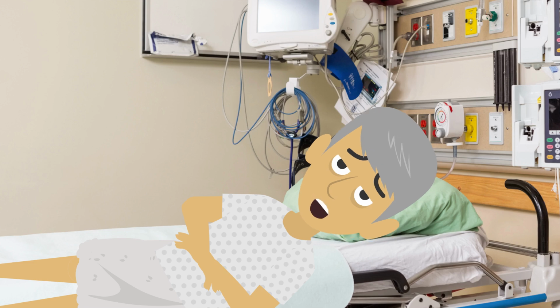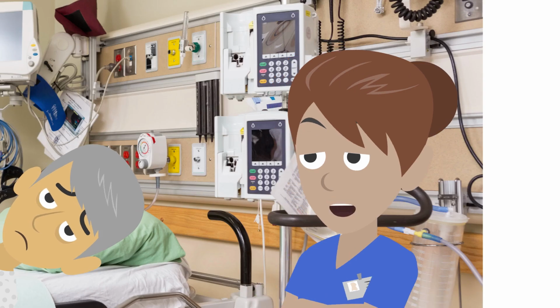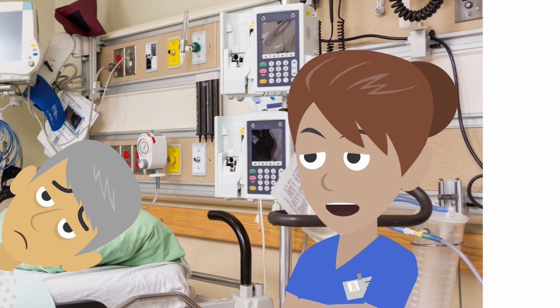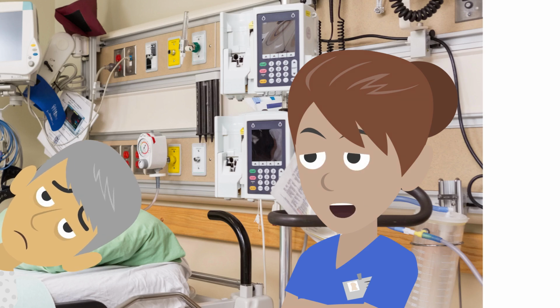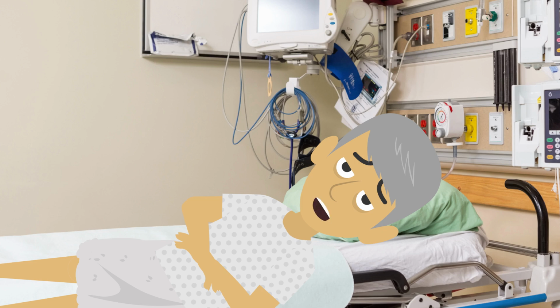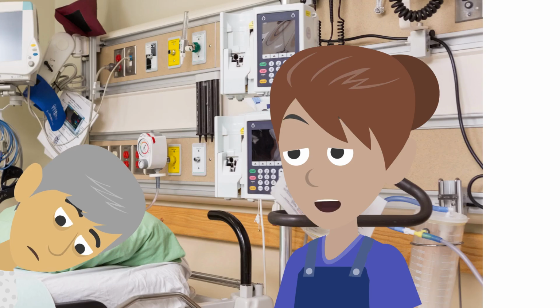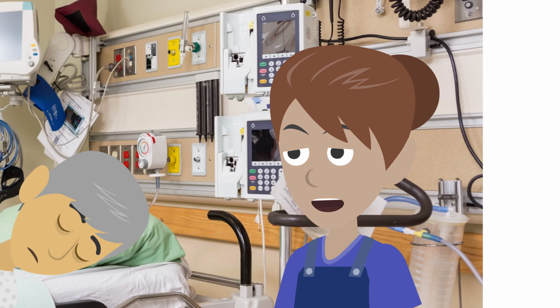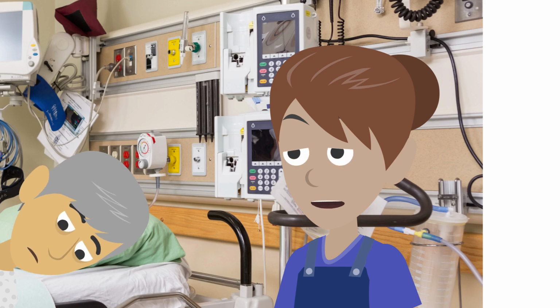What if it's not in the right place? If I notice any signs of distress, like coughing or difficulty breathing, I'll stop immediately. That would indicate that the tube is in your airway, not in your esophagus. Oh, okay. If it's okay, I'll help you to sit up in bed now. I'll put some pillows behind your head for support to make sure your head doesn't tilt forward or backwards.